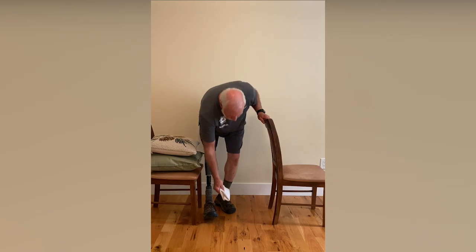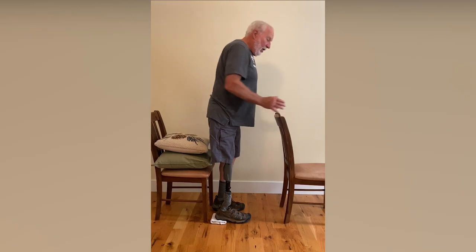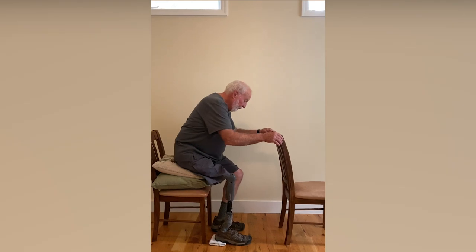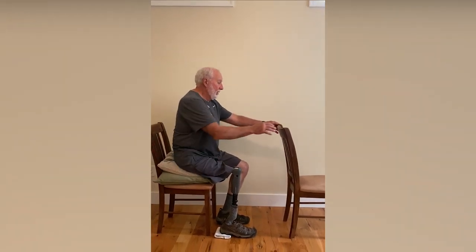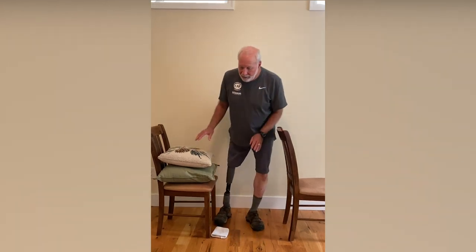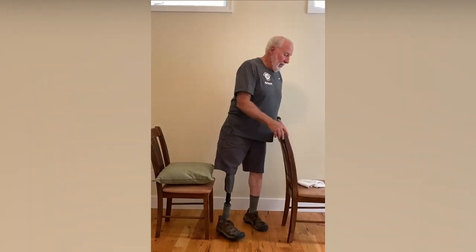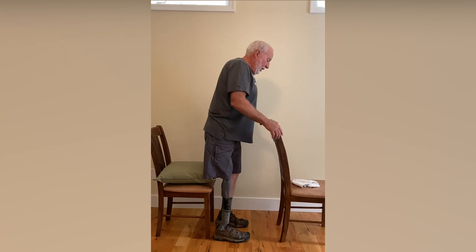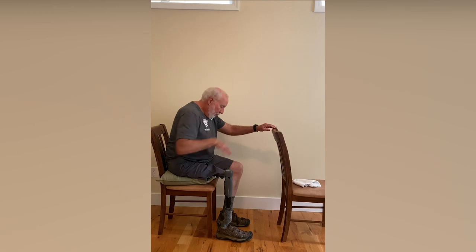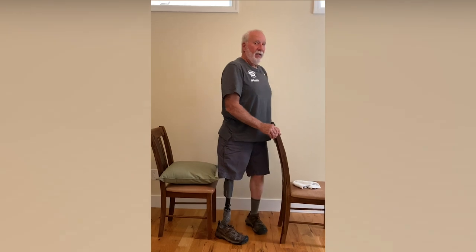A little trick is that you can put a cloth under the heel of the prosthetic side, like this, which helps you to get the knee to bend. And if you do that, then you're going to sit down and again consciously push with this side to get back up again. Okay, and as you get stronger, as your prosthetic side gets stronger, you can then lose a pillow, and then you're going to sit down a little further. Again, equal weight, sit down, and as you get up, you're going to push with this side and this side together, like this, and that helps you to get up out of a chair.